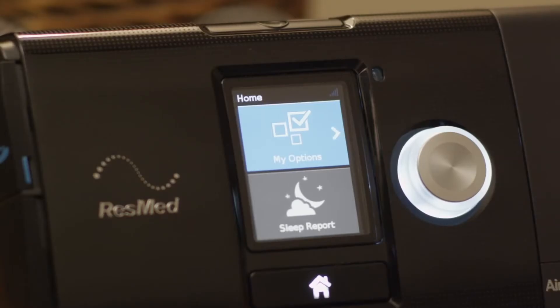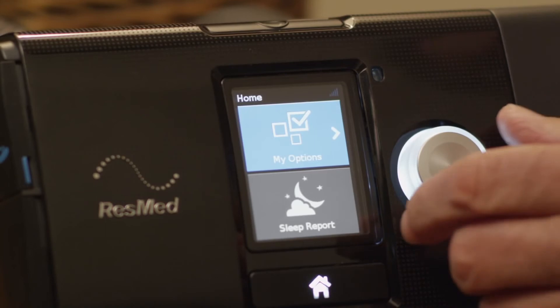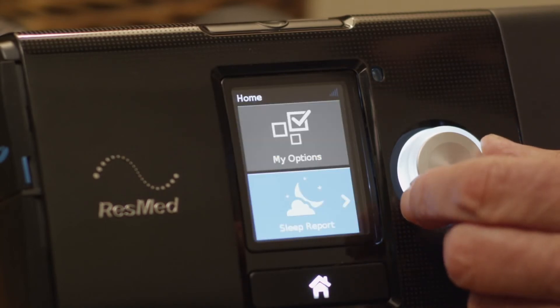My Options lets you view and personalize your comfort settings, while Sleep Report automatically generates a summary of your last therapy session when you press stop.